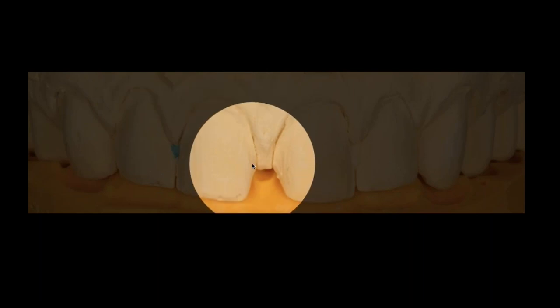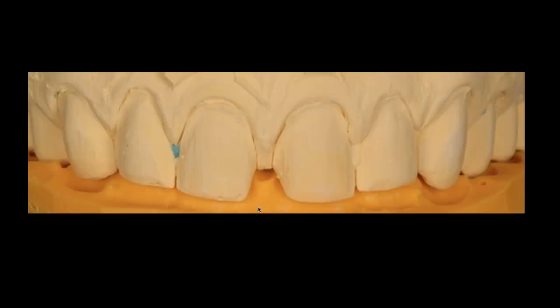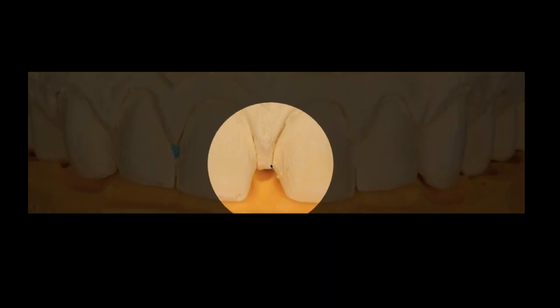The doctor did very minimal preparations on the facials and yet brought the lingual margin way back to the lingual, so I could have now room to emerge that contact area and create my own contact area as I work through the process. And that's what I mean by that elbow prep, where the prep actually comes back here like an angle and then comes back up. That's that little elbow that you want to make sure you're getting inside the preparation.